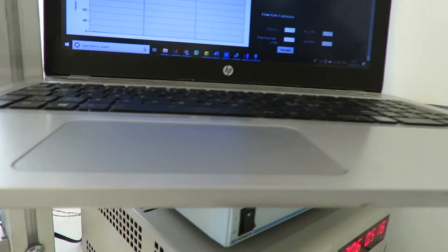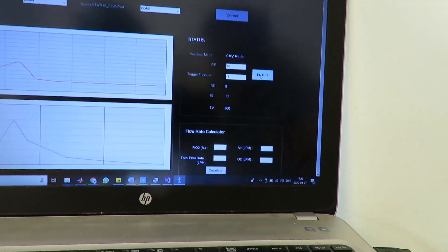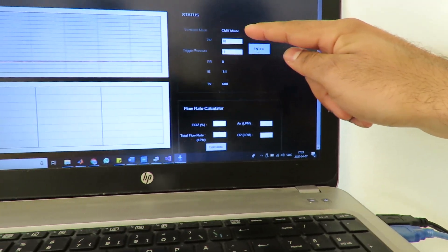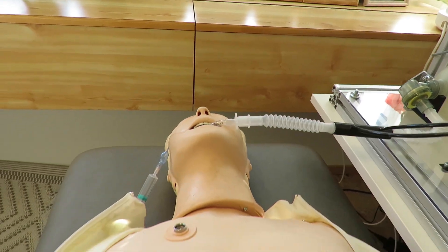The pressure in the airway is also continuously monitored with the differential pressure sensor in order to maintain the pressure between the set peak inspiratory pressure and the positive end expiratory pressure, PEEP, that is manually set at the ambu bag. Now I will show you a demonstration of the two modes in our ventilator.